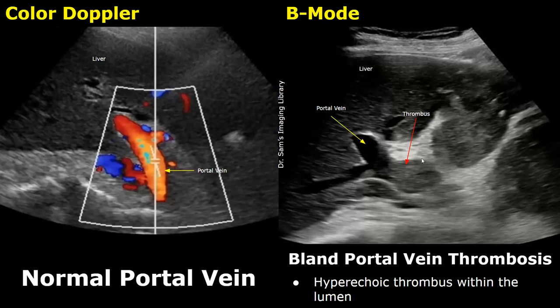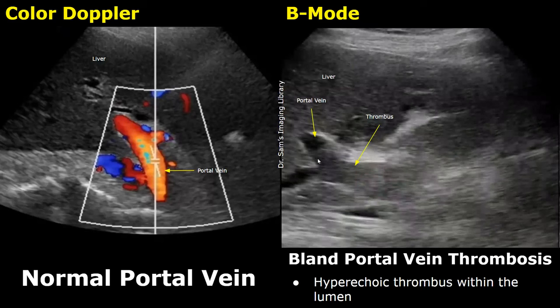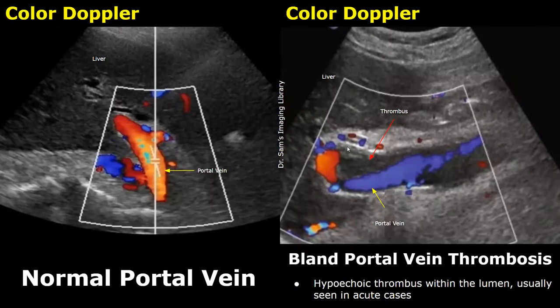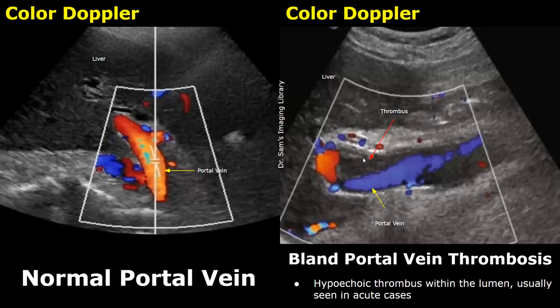On ultrasound, the thrombus may appear as a hyperechoic structure within the lumen of the portal vein, while the normal lumen is anechoic. In acute thrombosis, the thrombus may appear hypoechoic and can be difficult to see on B-mode ultrasound, so color Doppler is much better in locating these types of thrombosis.